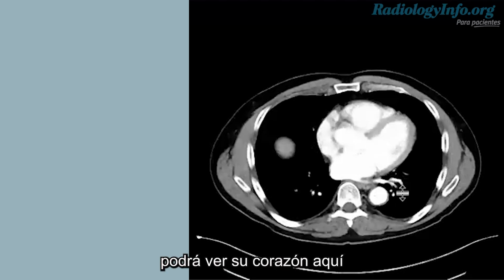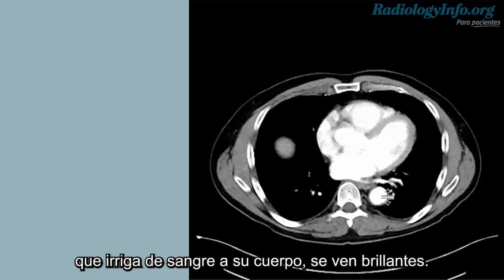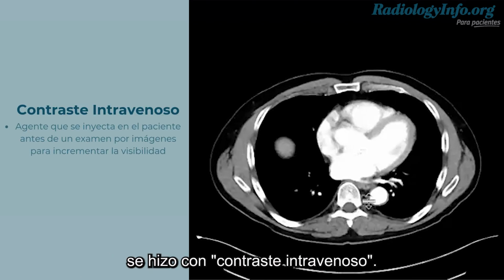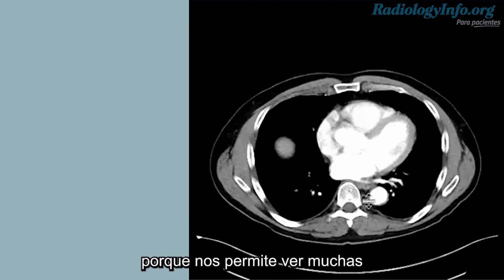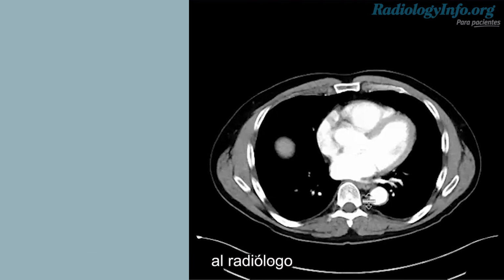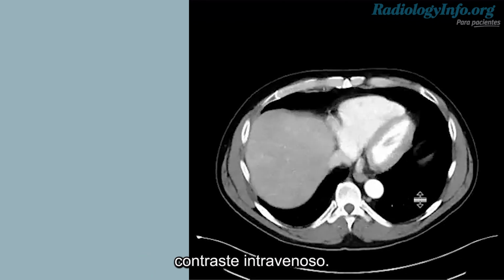On these images, you'll see that your heart here and your aorta here, which is the main blood vessel that gives blood supply to your body, are bright. They look white. This is because this scan has intravenous contrast. Intravenous contrast is very important for us in radiology as it allows us to see many things much better. On a typical contrast-enhanced scan, the radiologist will have a much easier time picking up subtle findings in your organs compared to a study where you don't get intravenous contrast.